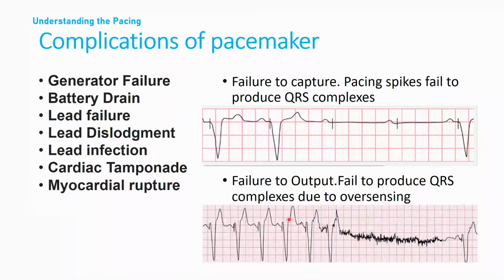Here below, no spikes are seen. It's all noisy, but there is no spike, which means the pacemaker has sensed something else and inhibited pacing. Inhibition means it has not delivered the impulse. This can happen if pacemaker patients are dependent on pacing. Doctors may call for general surgery or thoracic surgery, where they may use electrical cautery.